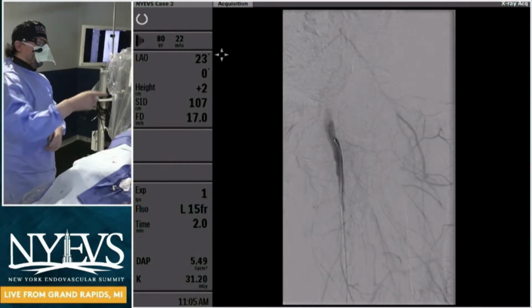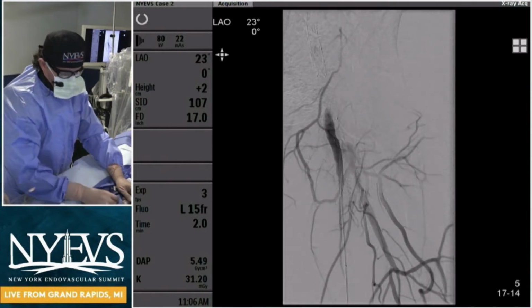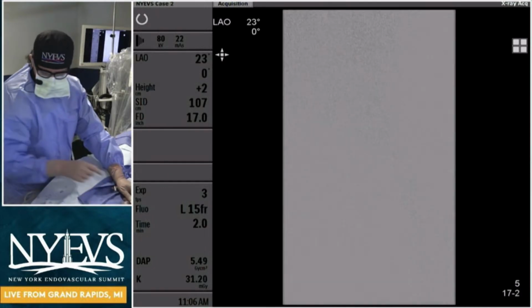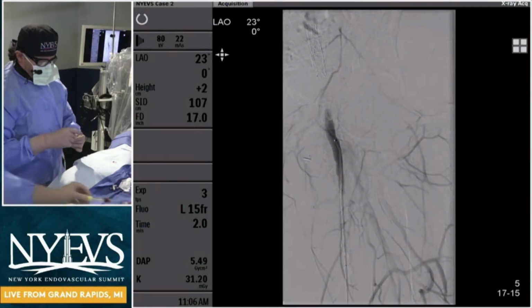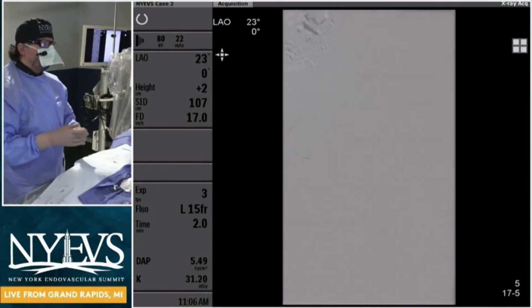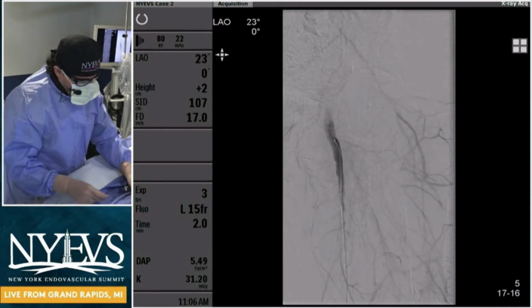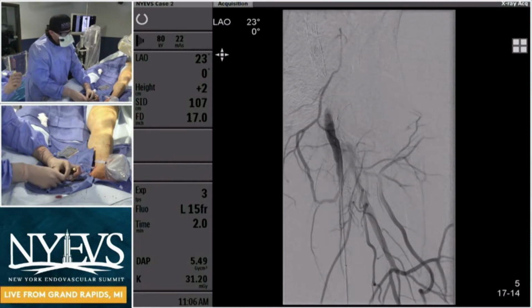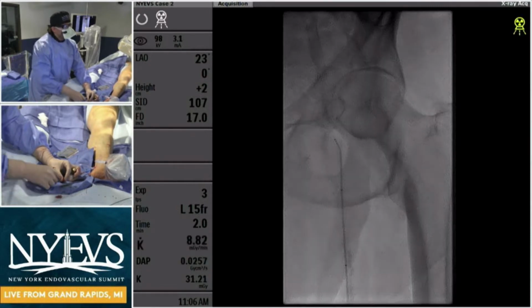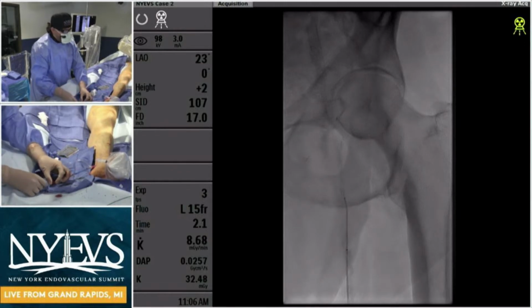So if you guys notice, my 035 catheter is occlusive. Yeah. So when you do IVUS, do you do IVUS at this stage to figure out the areas where you want to intervene, or are you going to use the angiogram? Before we started, the bypass graft and the vessel had barely monophasic flow through it, and it looks like there is also high-grade stenosis within the stent itself. Mm-hmm. So all of these things, I'm already preparing in my head: what do I need to do for this patient? I already have IVUS open on the table that we're also going to consider.